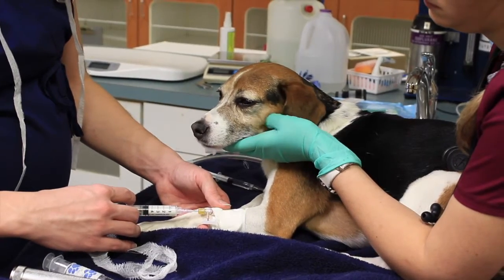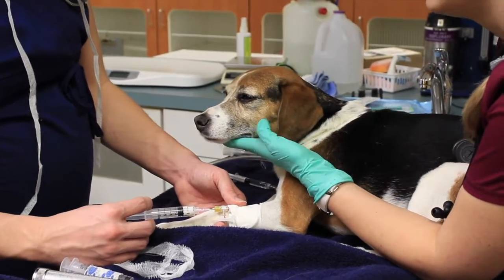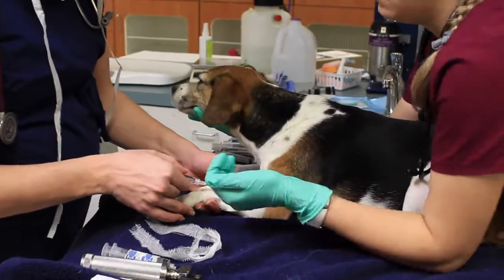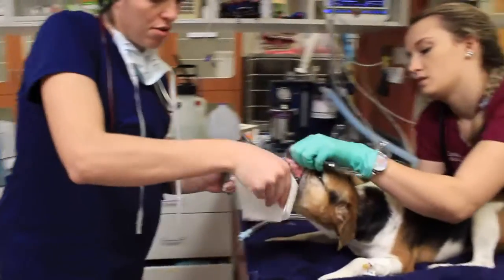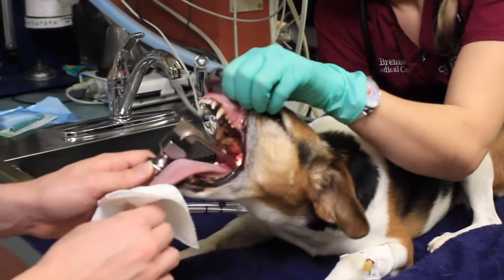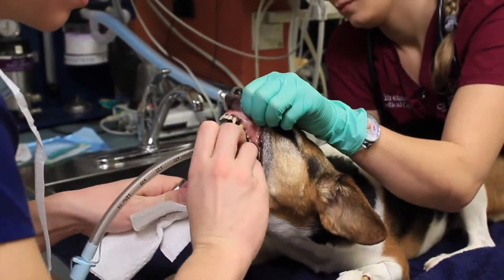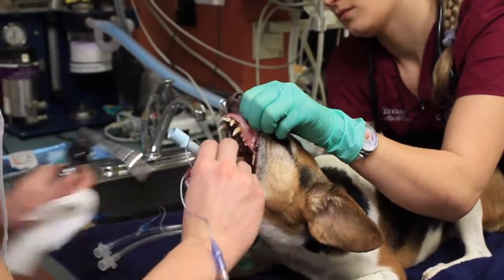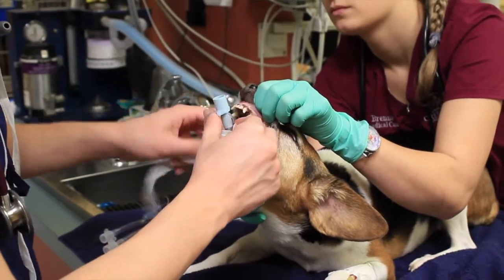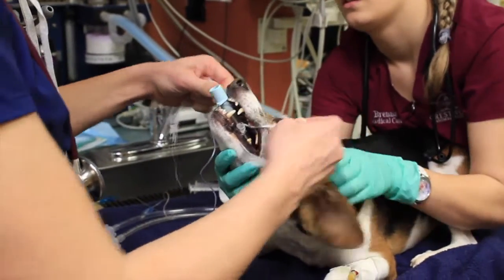We're going to make sure that the catheter is still working. Brenna's going to hold the mouth open really wide. We'll use the laryngoscope to see the back of the mouth so that we know that whenever we're placing this tube it's going into the trachea. We place a tie onto the tube so that we can tie it to the muzzle and know it's secure and not slipping or falling out during the procedure.